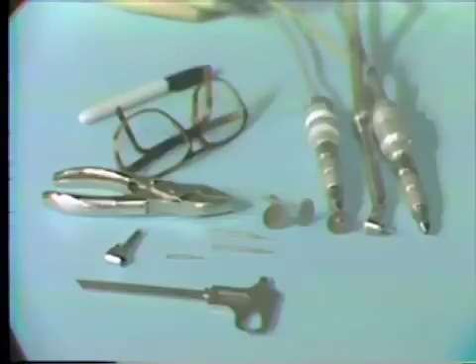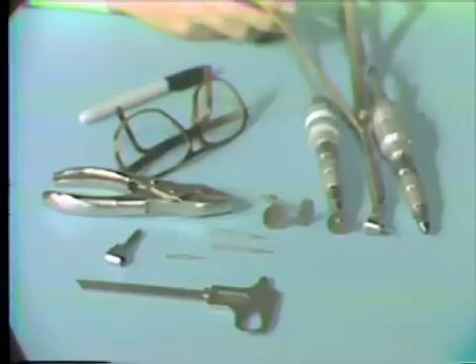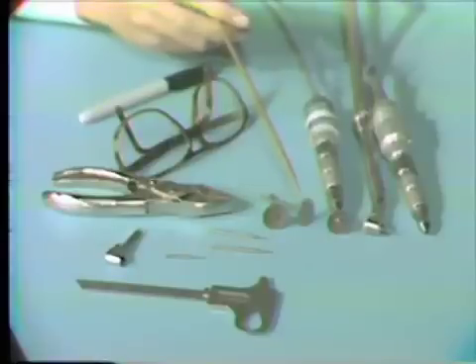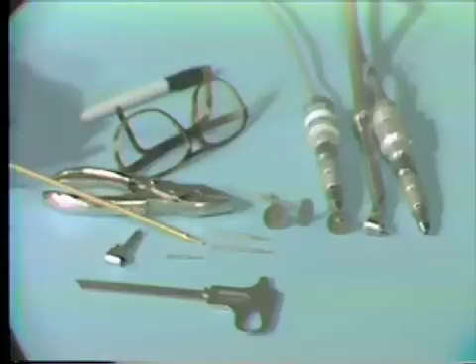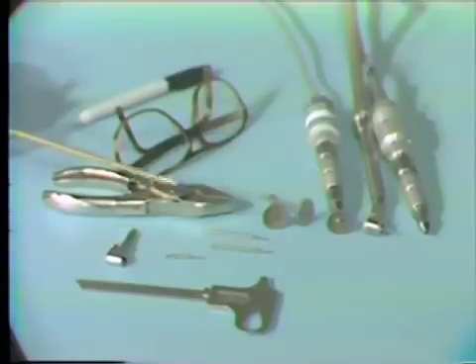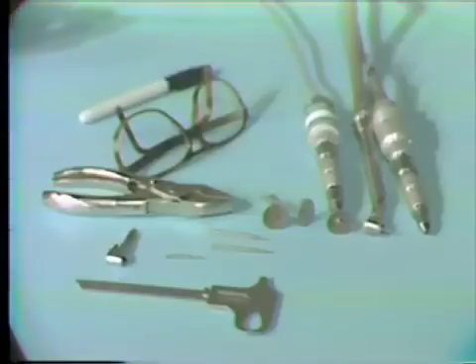The materials needed for this presentation are an electro-torque with a straight handpiece, a high-speed with the number 56 burr, or an additional electro-torque with a straight handpiece, a carborundum disc, a heatless stone, the latch burrs that you're going to use as a model, the straight handpiece burrs, a Bowley gauge for measuring accuracy, the latch head itself for testing the fit, pliers for holding the burrs, safety glasses — which should definitely be worn — and optionally, a Sharpie pen to mark the location.